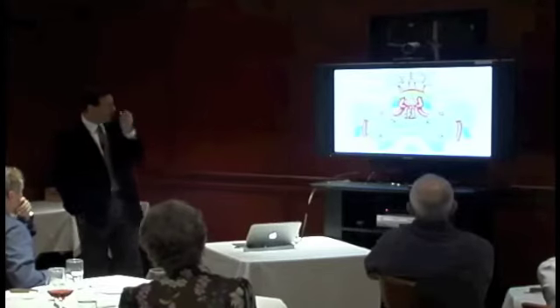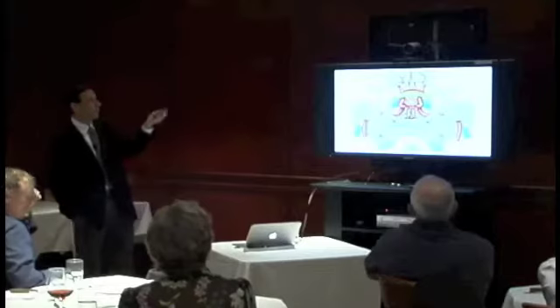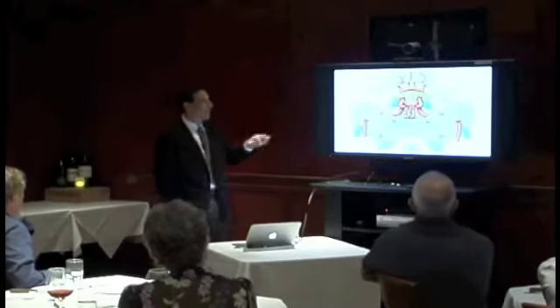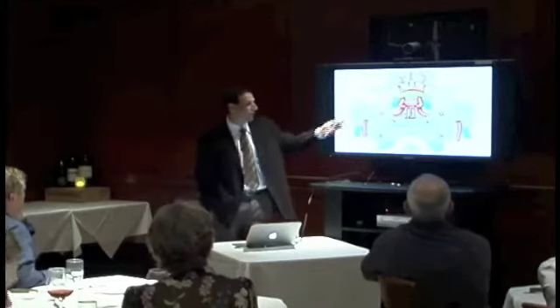When you open up all of this bone, this is basically what you're going to find behind it. As you go upward in the rostral, you're going to find the anterior cerebral arteries and the frontal lobes. As you go inferiorly, you're going to find the brainstem and the basilar artery. And as you go laterally, you're going to find the cavernous sinus, the carotid arteries.